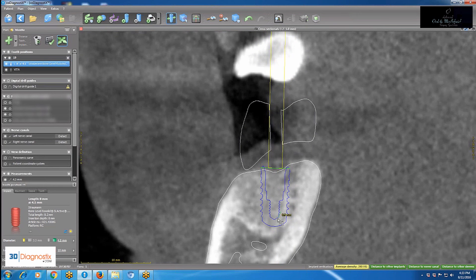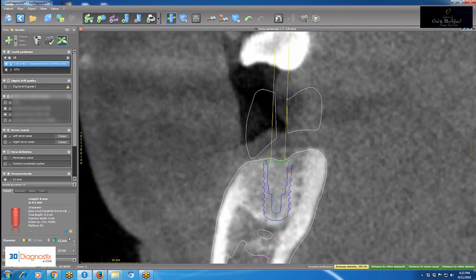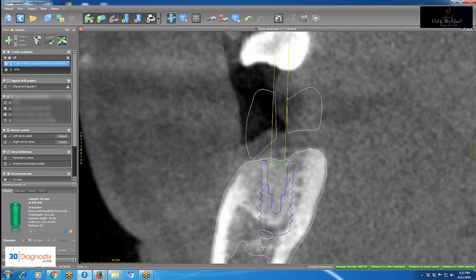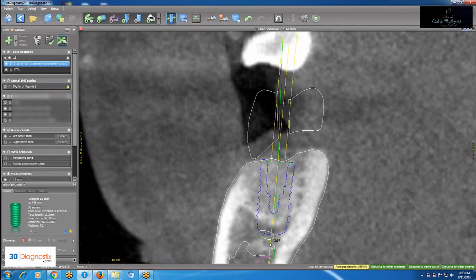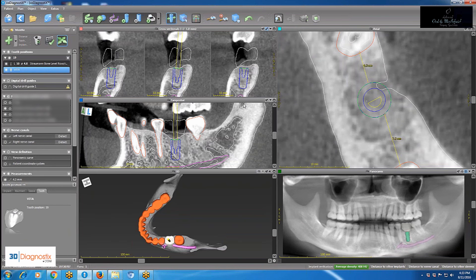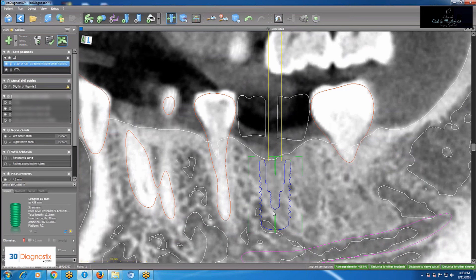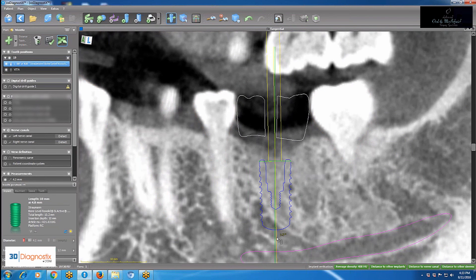In the cross-section view, right-click and hold to change the angulation, left-click and hold to change the position. If I realize the implant could be wider or longer, I can change it using a shortcut, making it 4.8 by 10.